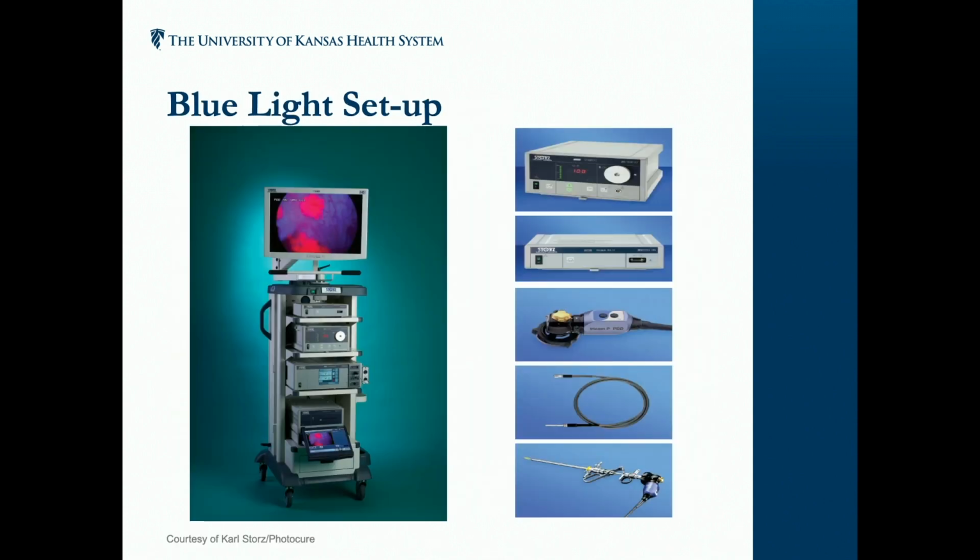Here's the problem with blue light, I think, and why not as many people have probably utilized it: you have to have all this equipment. You have to have the special tower, the special box, the special light, the special scope. All of those things are necessary, and so there's a significant startup cost. And when I've talked to other practitioners, they've said, my hospital won't buy this because it's too expensive to get this new equipment. And I certainly understand that.